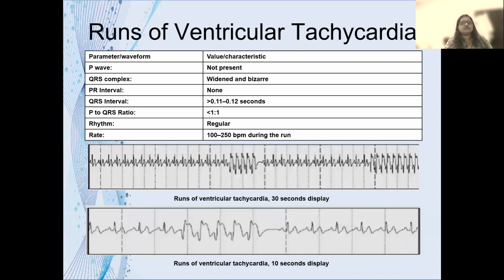Ventricular tachycardia is almost a cardiac arrest. You may not have a pulse when the patient has ventricular tachycardia. Pulseless and with-pulse forms both exist, so you have to check the pulse of the patient. Here you can see that wide QRS complexes are present.